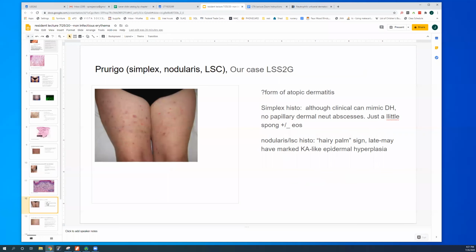Do you see that up here? Maybe in Salem you might see more down in the valley, more ashy dermatosis. Nobody, huh? Okay, let's move on to prurigo.